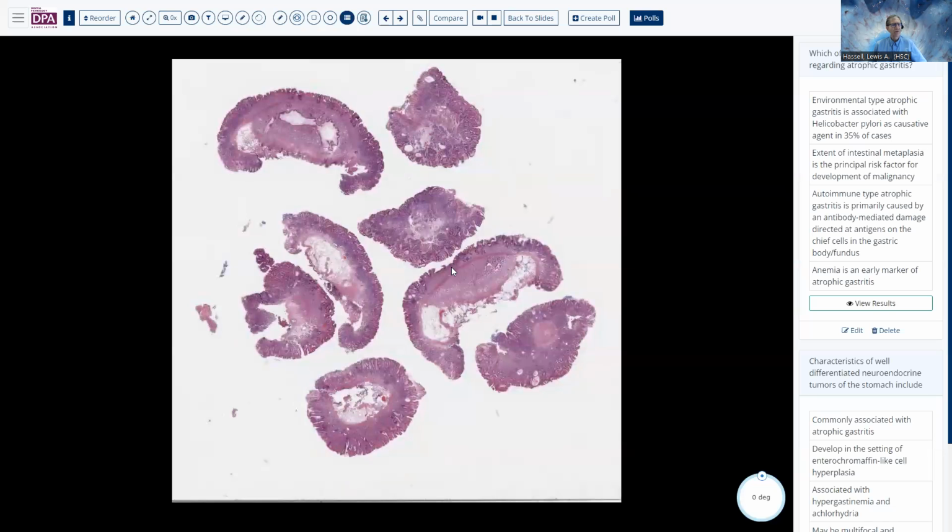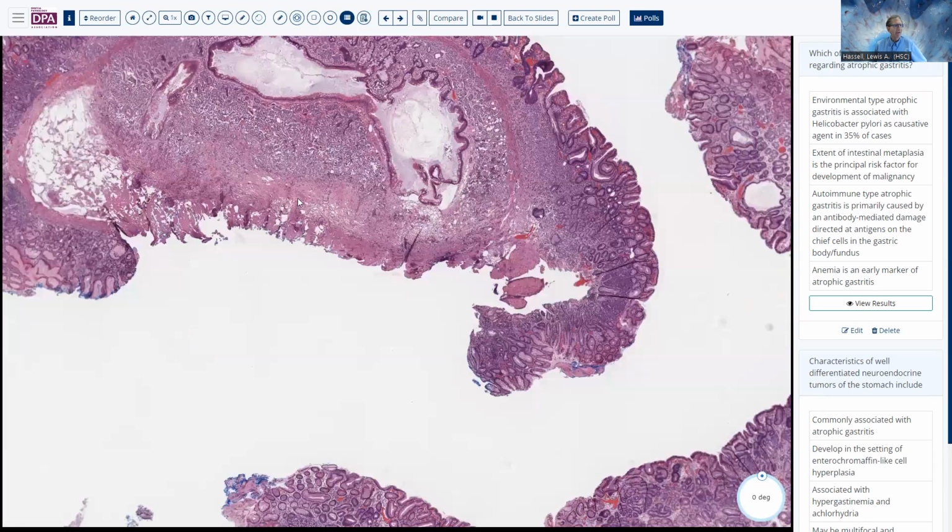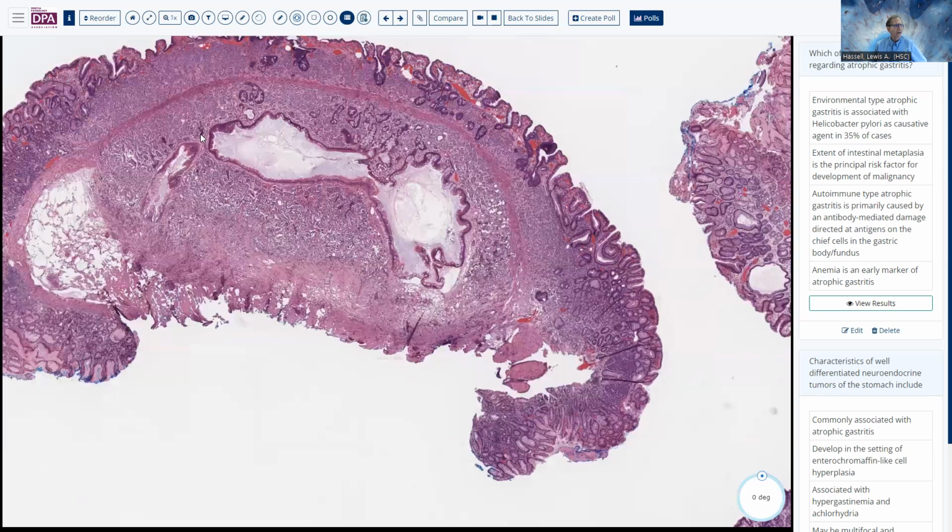All right, well, staying with a similar theme, let's move over to the stomach. And here we see a nice set of biopsies, actually another endoscopic mucosal resection. We have some very accomplished surgeons who are good at that. And maybe continuing this combined theme, we have certainly what looks like a neuroendocrine tumor here, but also some glandular elements here that have been at least associated with it.